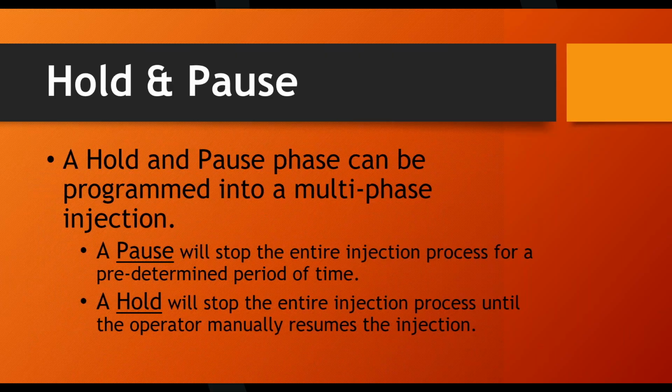It's rare that they use a pause. Pretty much anytime you see a protocol like this, it's a hold. When we buy these injectors used, obviously, there are always protocols stored in memory when we get them, for training. We'll go through the protocols. I've never ever seen a pause stored in memory. It's always holds, always holds.